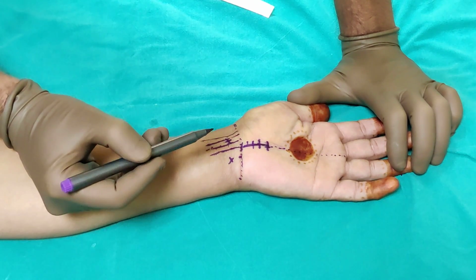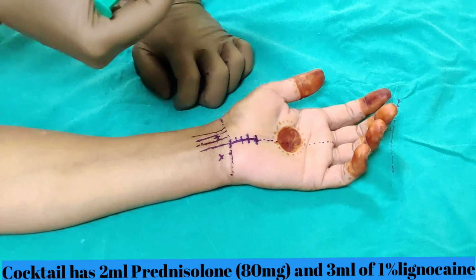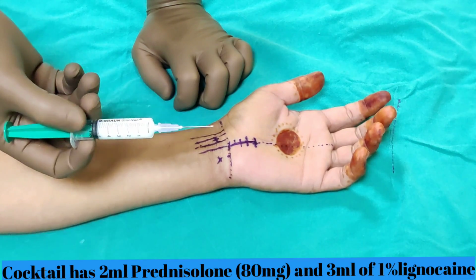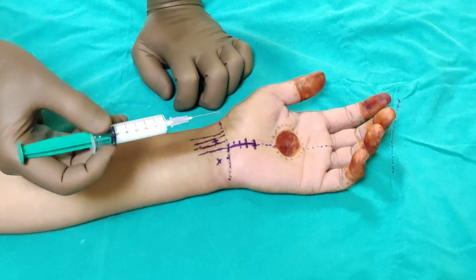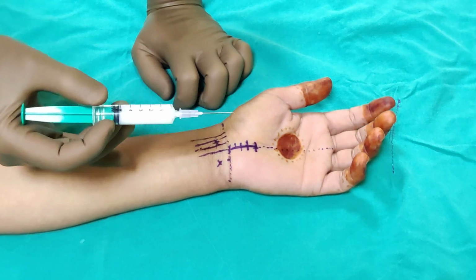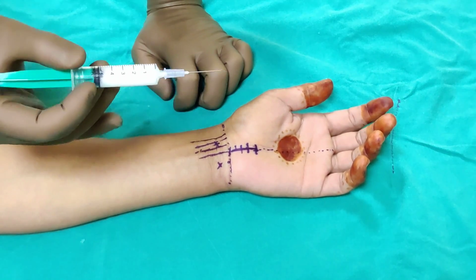So now I'm ready for my injection, and I will show you how I do it. A cocktail, if you are doing it ultrasound guided, you can just give steroid 1 or 2 ml depending upon your choice. When I do it blind, I always increase the volume so that even if you are not at a perfect position, it will spread and you will get a good result.